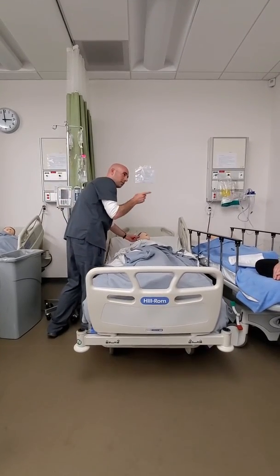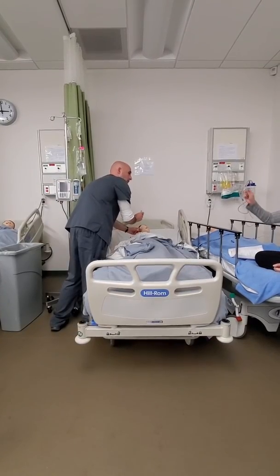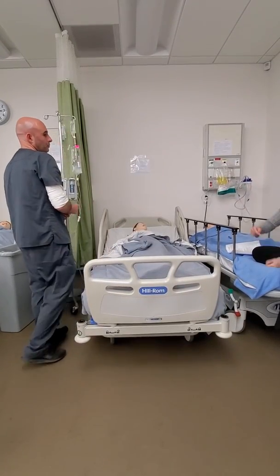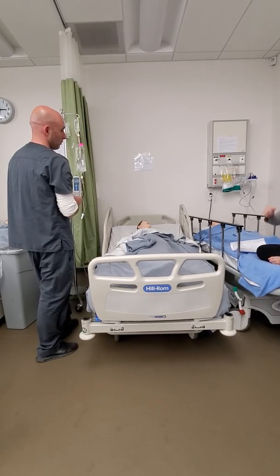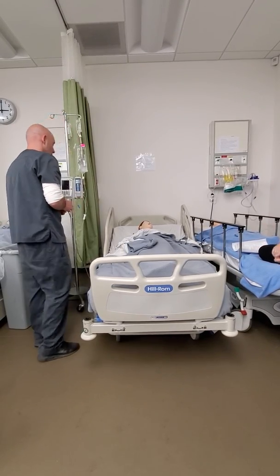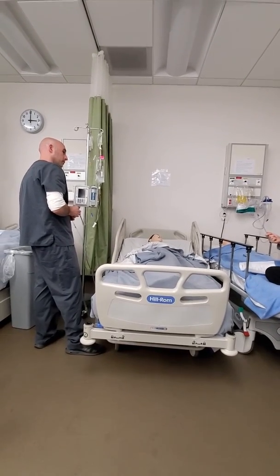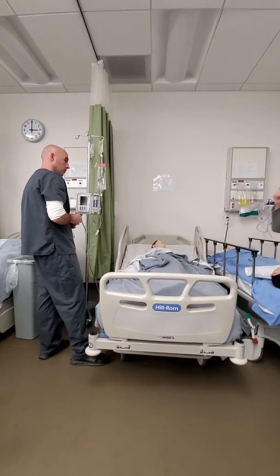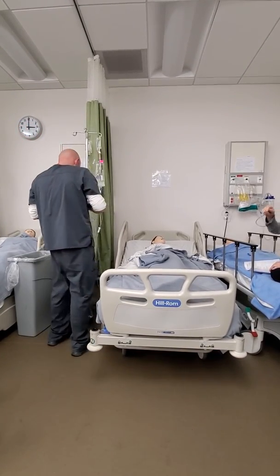And then sharps. So I have to locate the sharps before I come in the room. If it's not right there, because a lot of times the sharps are on the wall behind the bathroom door, you can set it right on top of there or on the bedside table and then throw the sharps later. That's fine. And the less you have in your hands when you're learning the skill, the less you have to be holding on to, the better. Can you put the sterile cap on it? You wouldn't do that. Pretend it's sterile.